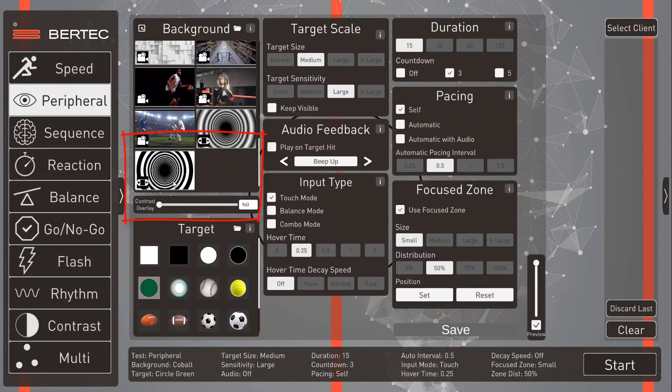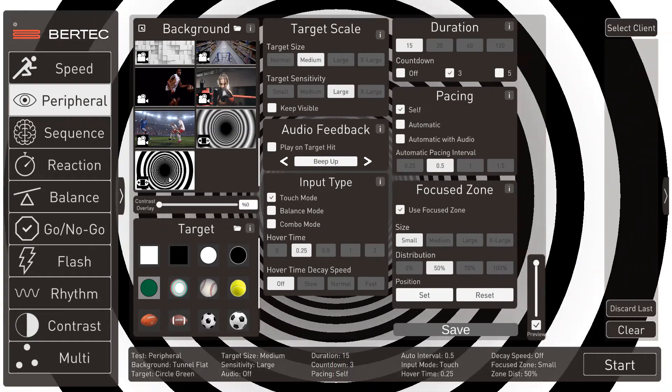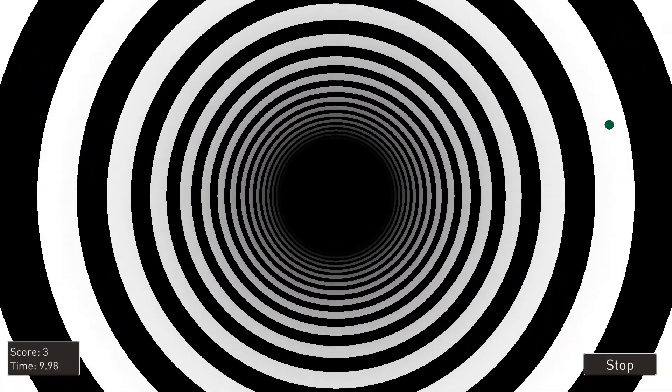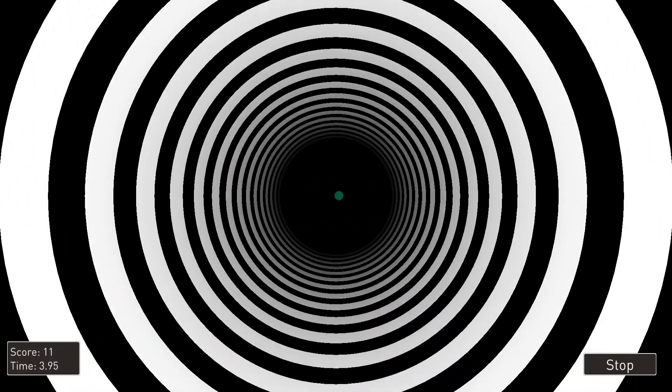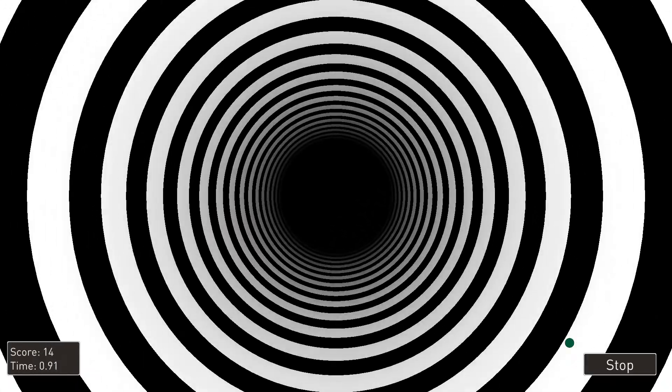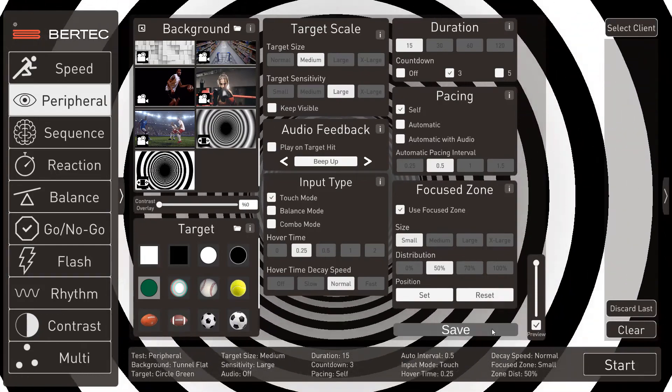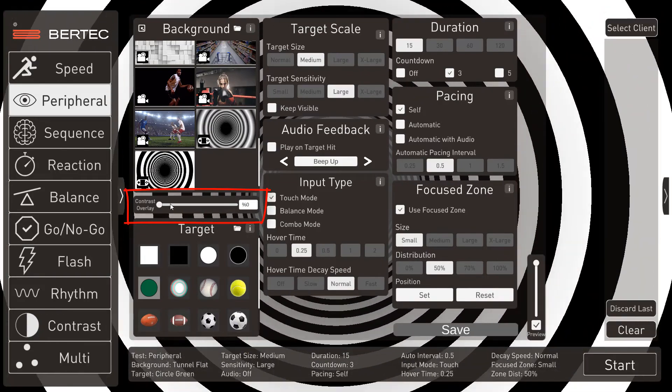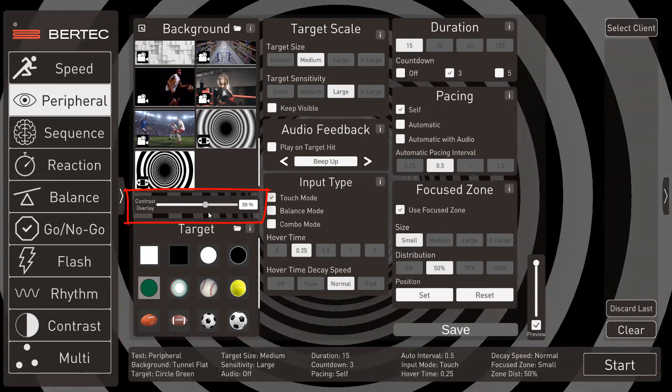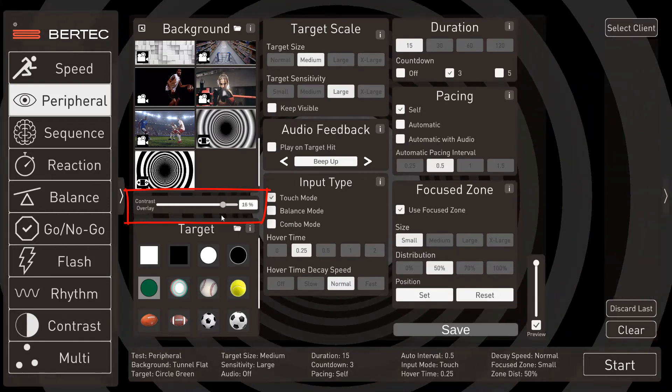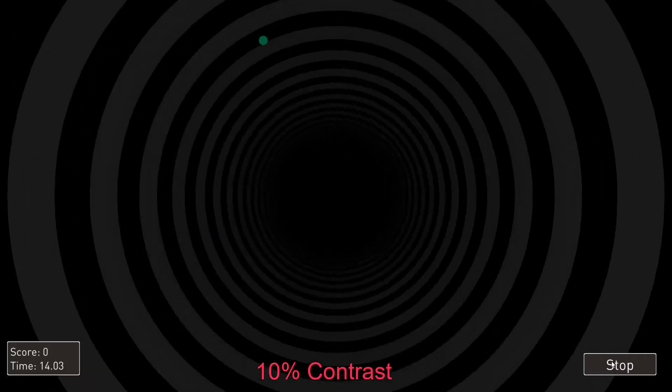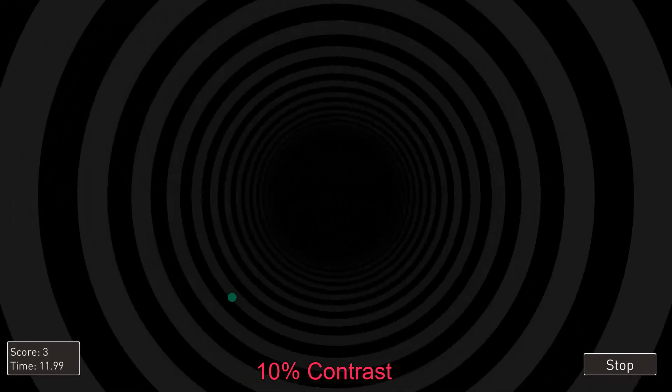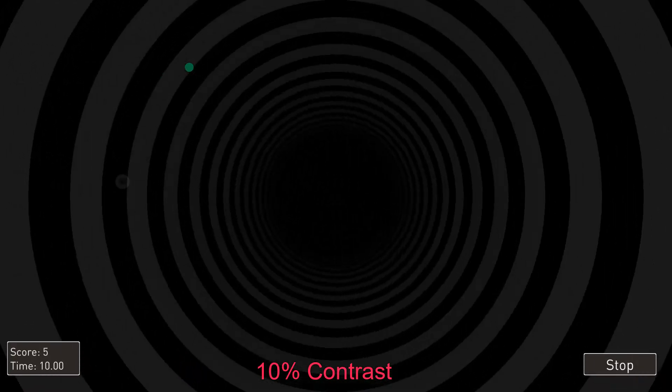Next, I would like to demonstrate this effect with the optic flow or concentric OKN stripes. Notice how fast the stripes appear to be moving at full contrast. And now note how the perceived speed and the amount of stress that's induced lowers by lowering the contrast. This is at 10% contrast.